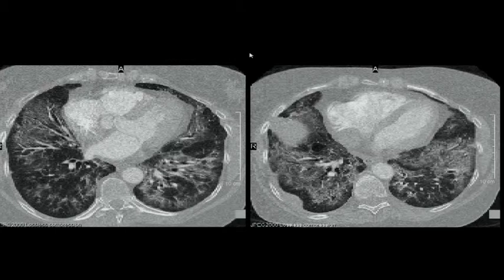No, Tope. UIP is totally different. UIP has no ground glass opacities or very little. Honeycombing, loss of volume, basilar predominance, subpleural cystic change. No, not at all. Pass it back to Hunter.